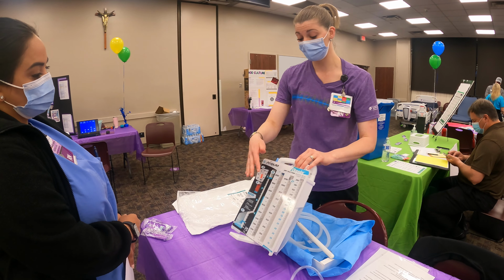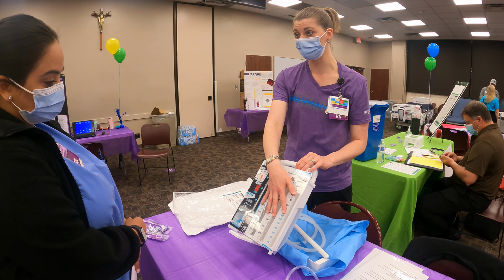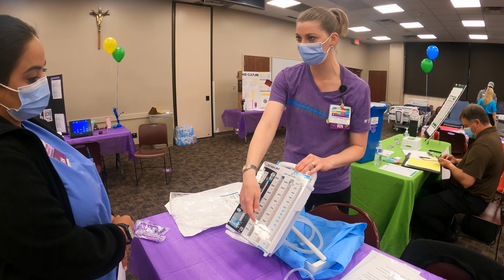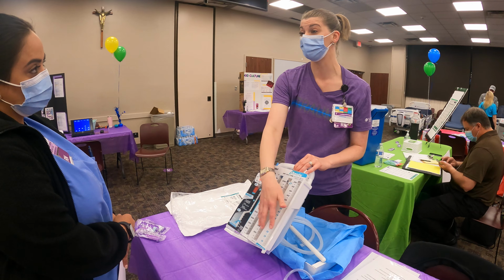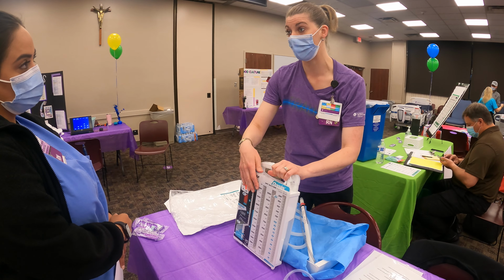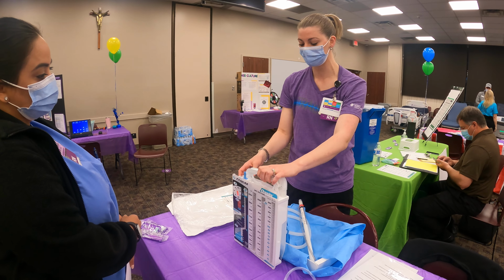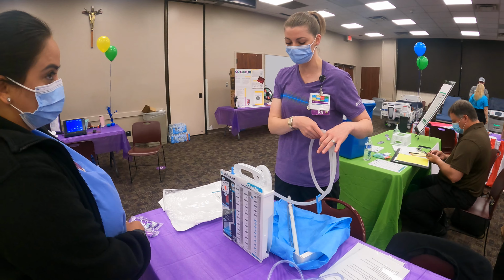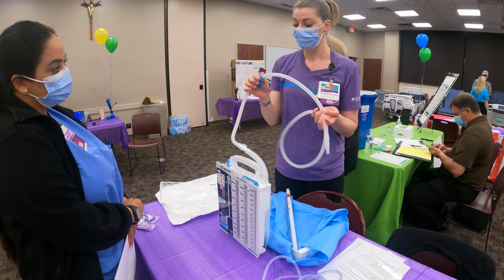So if there's output in the collection container and it gets moved, say you have 30, 40, 50, you're not going to be able to record the output as accurately. So you want to change the chest tube box, okay? So you want to change the atrium. The way that we do that, this is attached to your patient, attached to your chest tube. You want to clamp it.